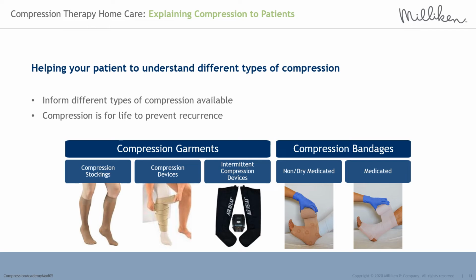Explaining compression to patients, helping your patient to understand different types of compression. Inform your patient that there are many different types of compression available and they will be prescribed different types throughout their healing journey and beyond. Reinforce that compression therapy is for life to prevent recurrence, and the best thing that they can do for themselves is to wear some form of compression for life.